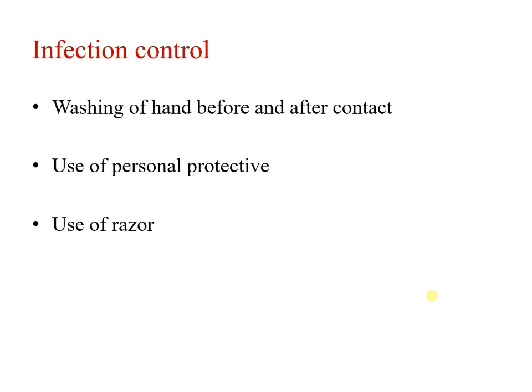Then use of a razor. In some cases, when there is body hair, you need to remove it. If you are using a razor for that purpose, then you must use a single razor for a single participant to avoid the infection of HIV.